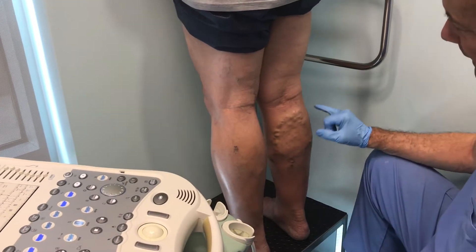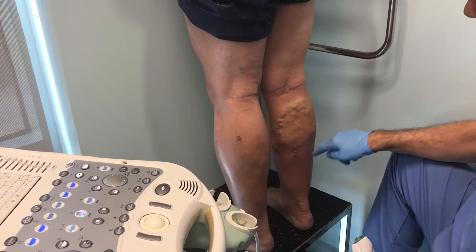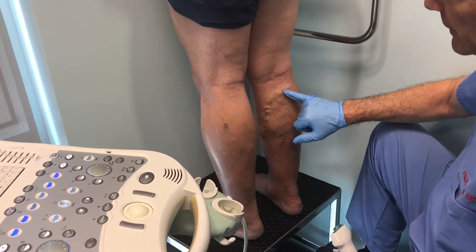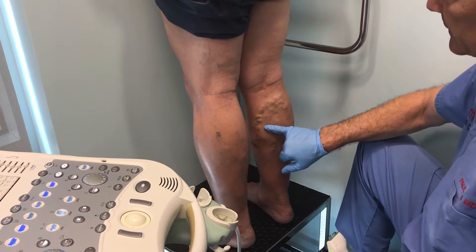We have a gentleman here that is coming to see us. He observed all these varicose veins on the back of his leg in this calf pattern. These are fairly painful. There's actually a lot of pressure if you put your finger on this when the gentleman's standing up. There's a lot of what's called venous hypertension to the superficial venous system.